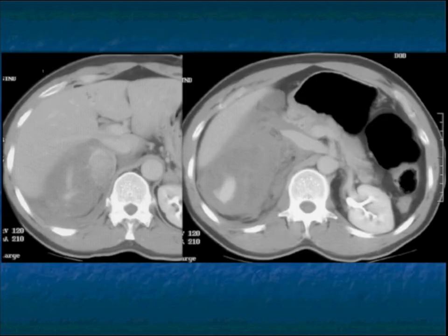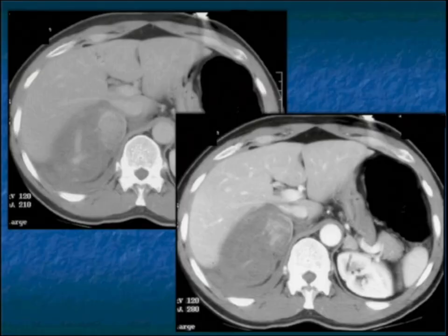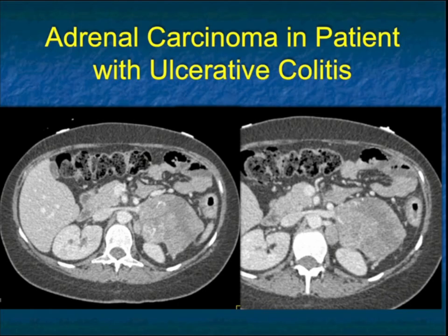Here's some more pictures showing you the acute bleed. Again, presentation is unique. Remember, we also talk about spontaneous renal bleeds. That could be underlying renal cell. It could be an AV malformation. It could be an angiomyolipoma. There are a lot of different possibilities. Something to think about. Obviously, trauma or biopsy are other causes as well, but this is very nicely shown in this example.